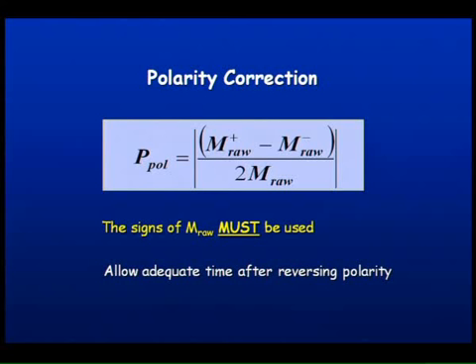And that polarity should correspond to the polarity for which you have obtained the calibration coefficient for your chamber. So if the ADCL provides a calibration coefficient, they will say at which polarity they have provided it, positive or negative. Then when you do your calibration measurement, you should do the calibration measurement using the same polarity.